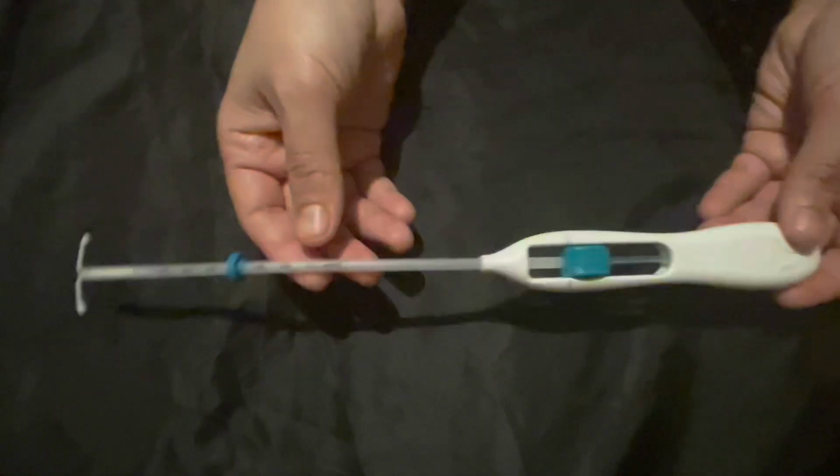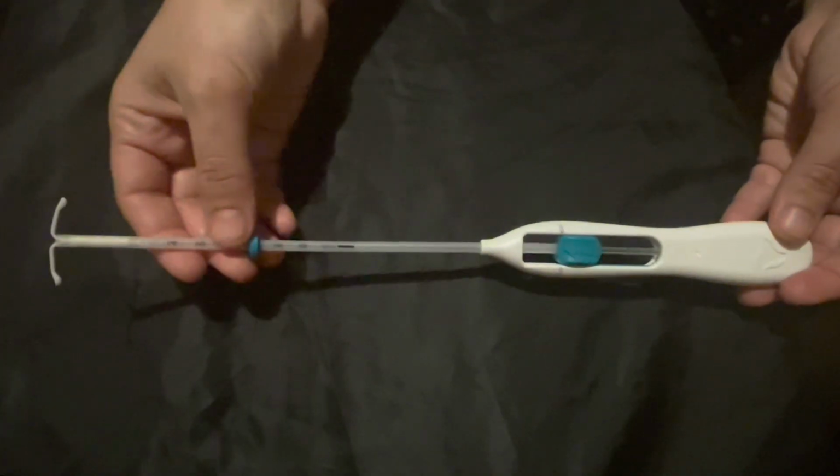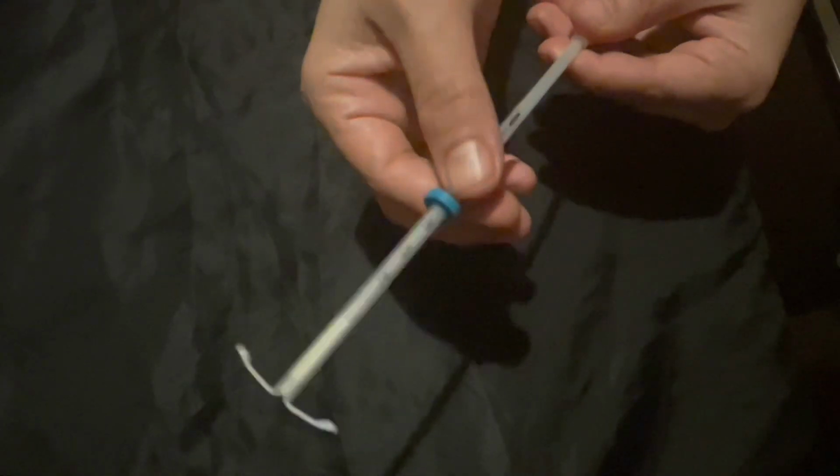When we open the package, we have the Mirena coil as we see. This part is called the flange. We can move it up and down according to the sound measurements. Here, as you can see, the arms come out, and you can't touch them when you insert the coil, it is a no-touch technique. The trick here is the slider.